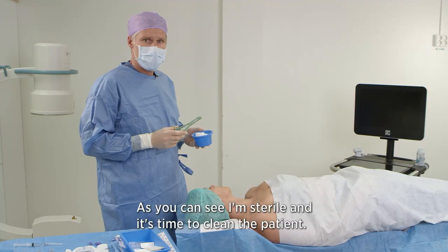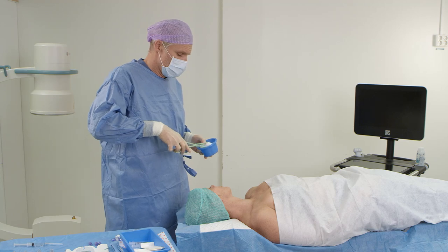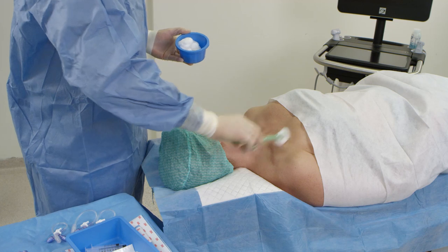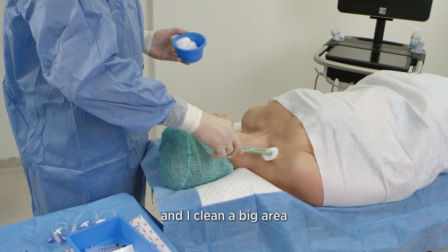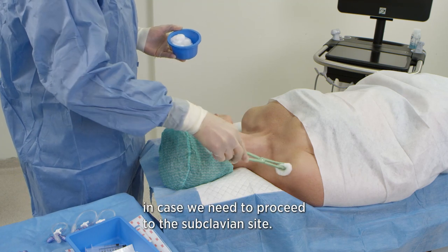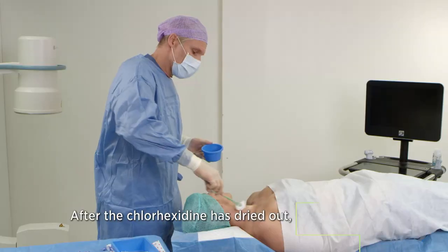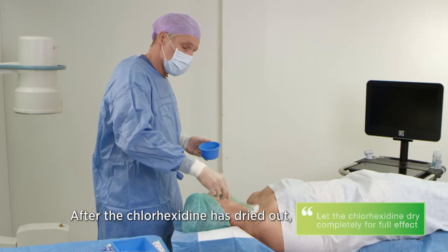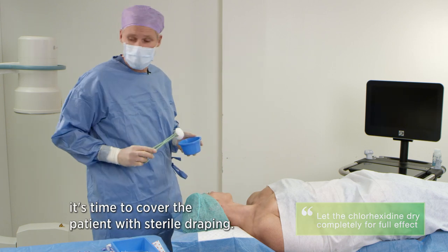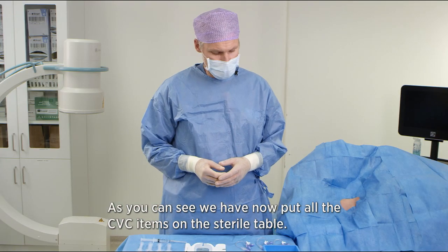As you can see I'm now sterile and it's time to clean the patient. I use chlorhexidine antiseptic fluid and I clean a big area in case we need to proceed to the subclavian site. After the chlorhexidine has dried out — and this is very important — it's time to cover the patient with sterile draping. We have now put all the CVC items on the sterile table.